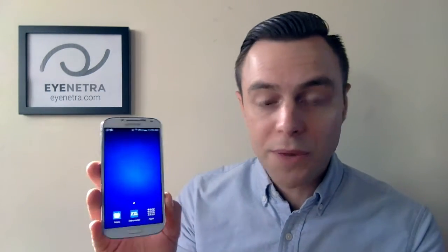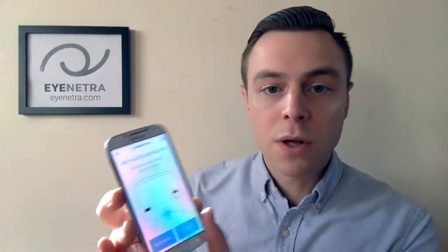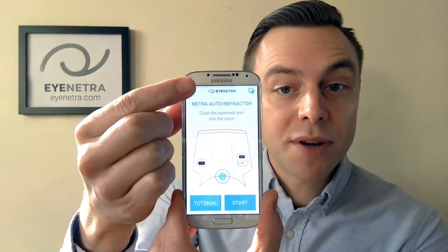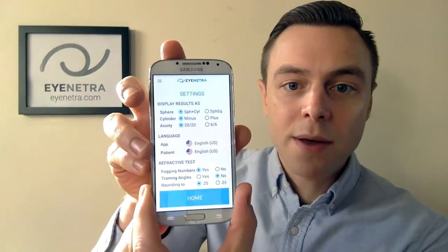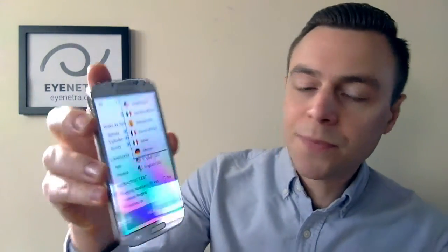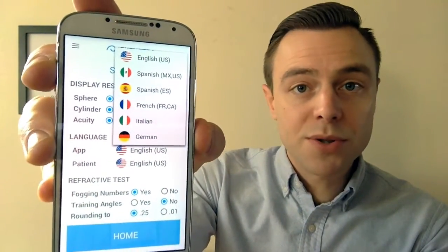The iNetra applications come with a variety of different language options. To change the language of the Netra autorefractor, open up the Netra app, select the drop-down menu in the upper left-hand corner, select Settings, and then select Language. Here you will find a variety of different language options to choose from.